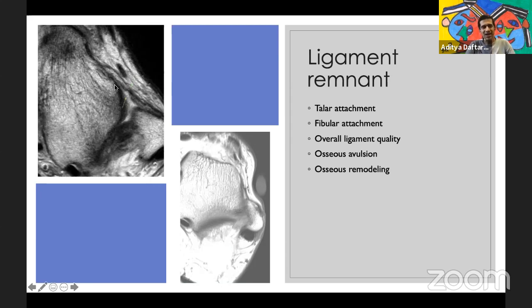So I think these are in a way just words that we use. And one of the things radiologists have to be careful with is that these are words the orthopedic surgeons we communicate with are aware of. In our practice, we work with a fair number of foot and ankle people. So when we say something is well remodeled or poorly remodeled, they understand what we're saying. We're just trying to tell them that this person will probably have more instability or not have more instability.